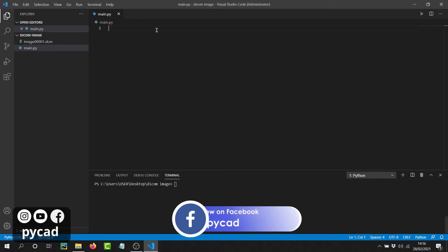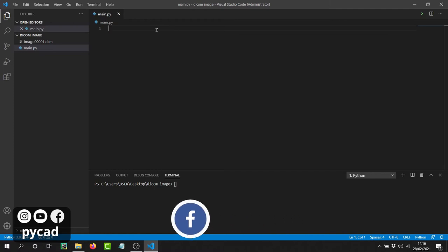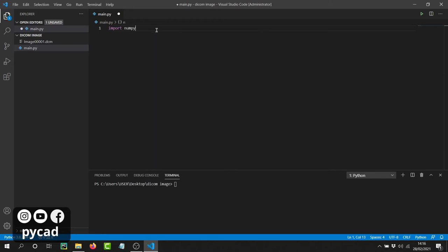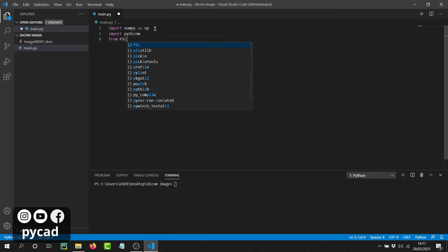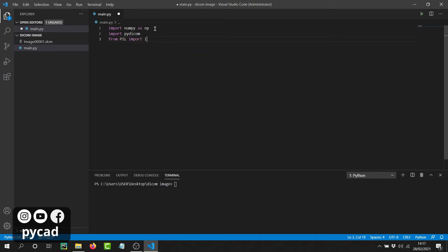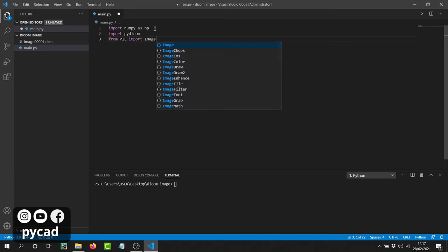Then we have to import them. Here we have `import numpy as np`, then `import pydicom`, and the third one: from PIL — which is Pillow — we will import the class `Image`.